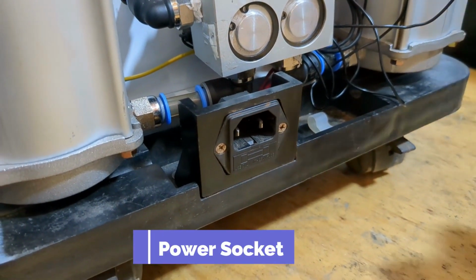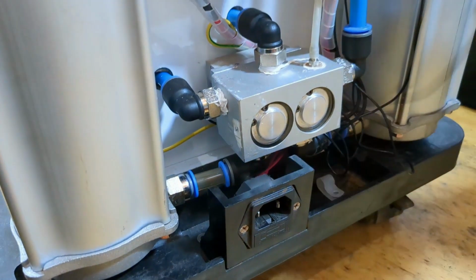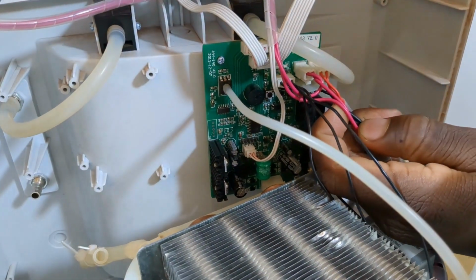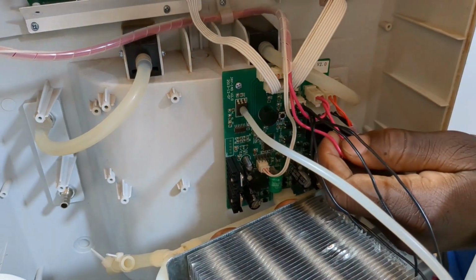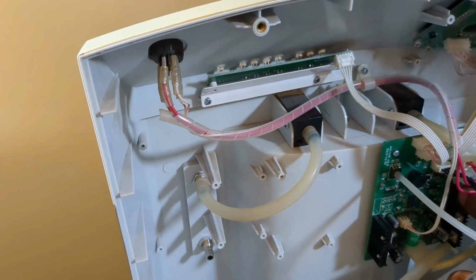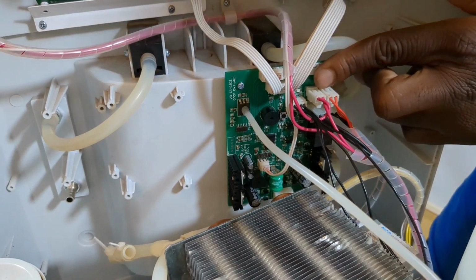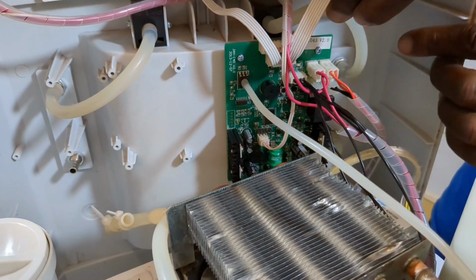So when you plug in your power cable, these two wires transmit the power. As you can see, these are the two wires from the power socket. One is a live wire and one is a neutral wire. The live wire goes to the switch, and this switch controls if the board is to get power or not. If the switch is turned on, power flows through this connector, and all of these four connectors are connected.